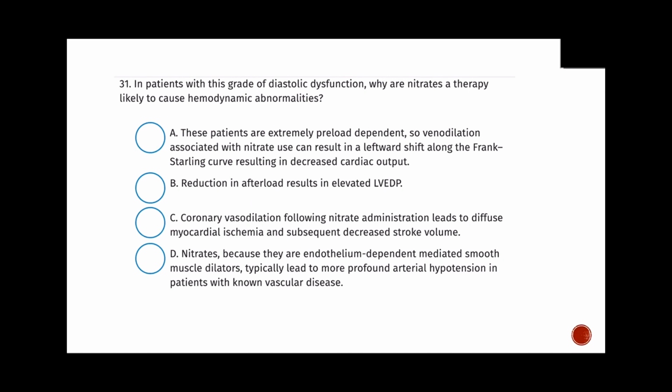So this is an example of when you're diagnosing somebody with shock who has potential diastolic dysfunction, you can look at all these hemodynamic parameters, and all the gentleman actually needed, despite his ischemic cardiomyopathy, was 500 cc's of fluid and cardioversion, and he never required any vasopressors. And that's only because we had some baseline echocardiographic data on him, and he left the ICU within 12 hours. So pretty cool, it's a pretty cool case to bring all of these things together.